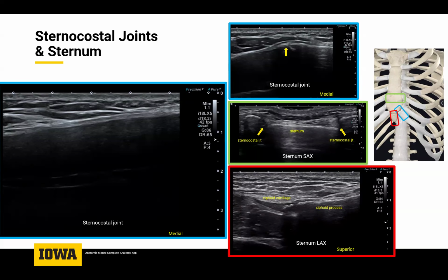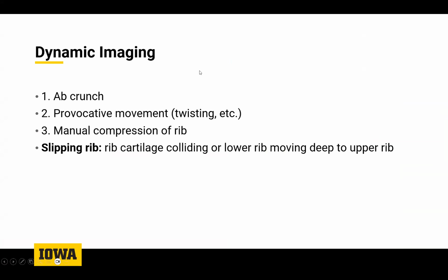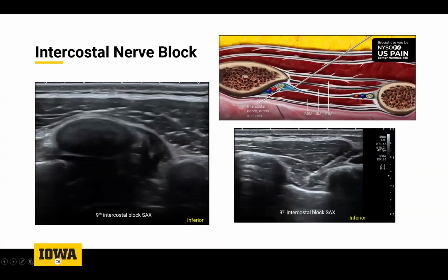I'll tell you, these are in combat sports. These are super common procedures that are done at the elite level, probably a lot more frequently than many people might think. And certainly they're not without risk, right? Ben showed those pictures. Yeah, you're tickling the lung, and so that's why it's super helpful when you're doing these to make sure you understand that anatomy.